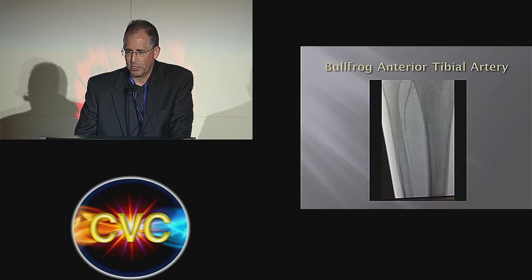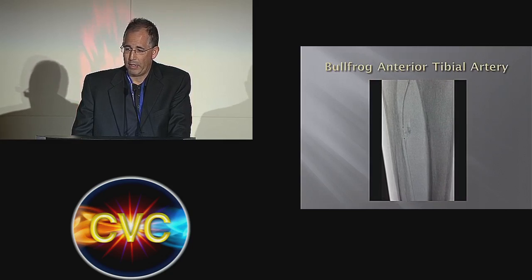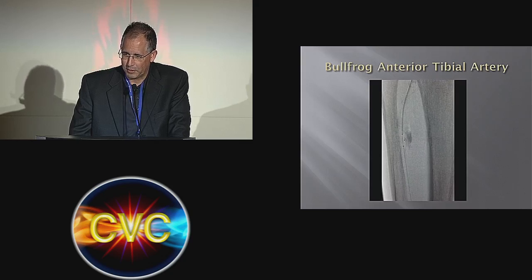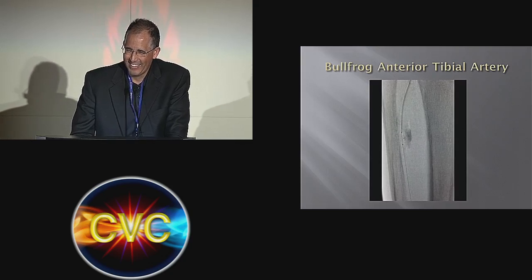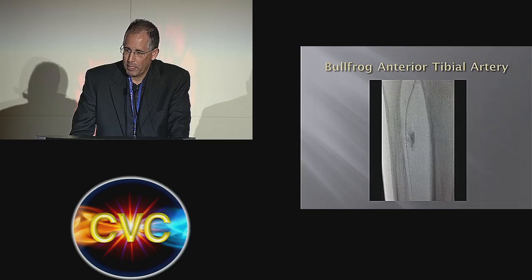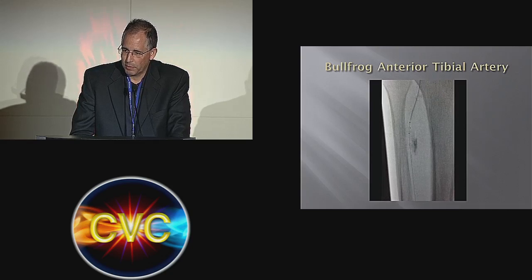I wanted to show you also a below the knee case. There you see the balloon inflating. Sorry, I had a nurse just holding the camera, and she had a shaky hand because I kept yelling at her to hold still. So there's the dexamethasone going in. And this is in real time. I didn't speed this up. So then you deflate the balloon, you move it, then reinflate the balloon.